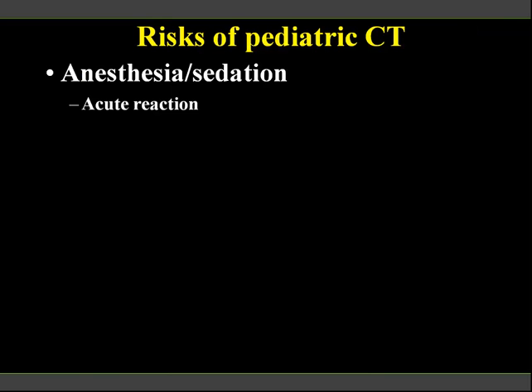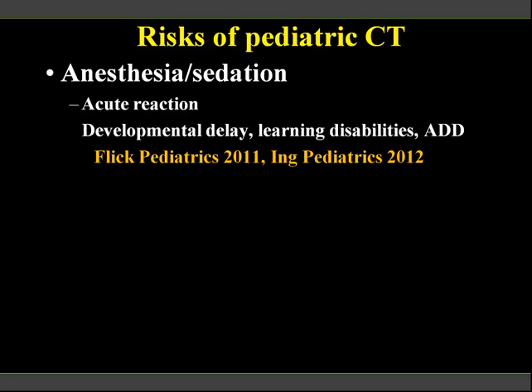So what are the risks of pediatric CT? It's not just the radiation risk. Luckily, we are able to sedate children less because of the fast scanners. Some scanners, the gantry travels at a speed of 60 centimeters per second, so there's less need for sedation in children. Now, the sedation, as it is being administered, can cause acute reactions needing admission in the ICU.